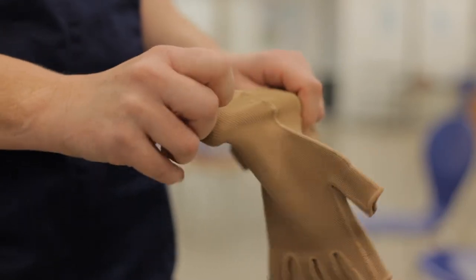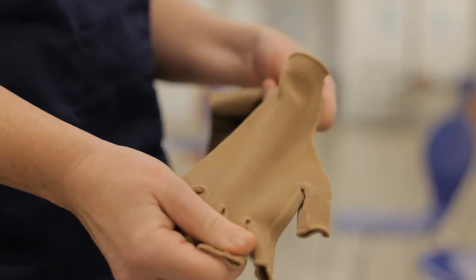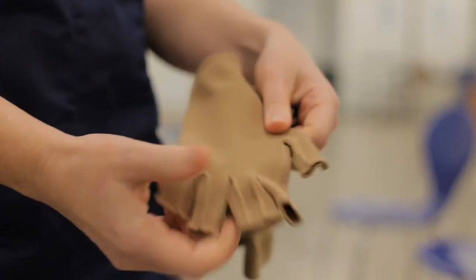There are all different types of compression garments depending on the area that requires compression, so there are different styles, different lengths, different thicknesses and stiffness of fabrics. There are also different colours which will help to match with different skin colours.